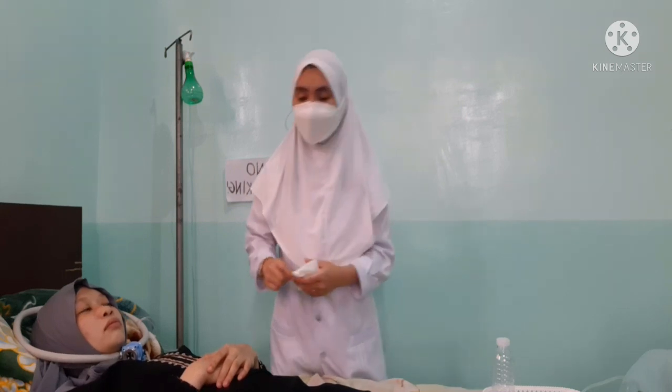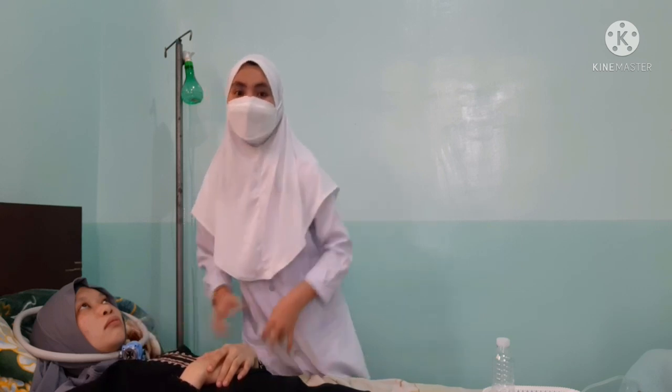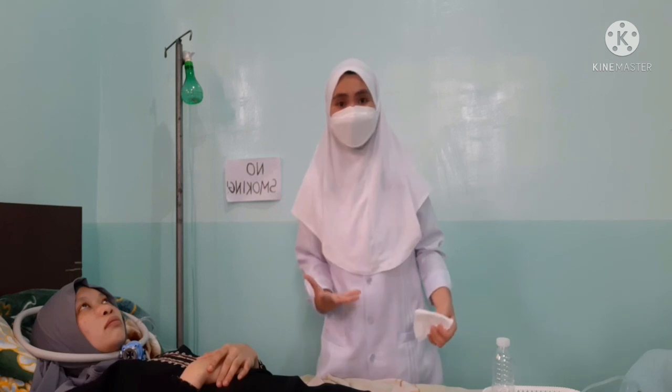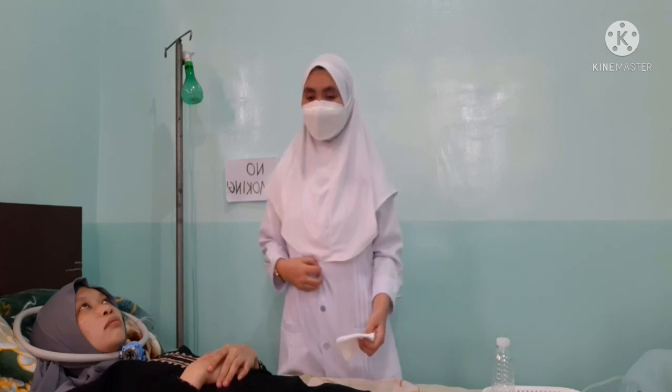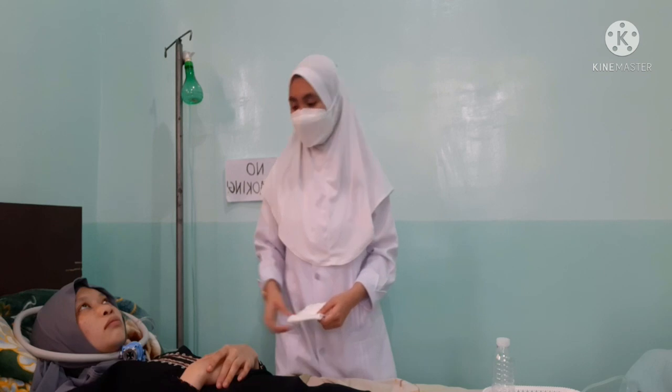Now, clean the collar with soap and water every day, or more frequently to remove secretions if necessary. Now, instruct the patient or the caregiver on suctioning. Use the frontal suctioning port of the tracheostomy collar.